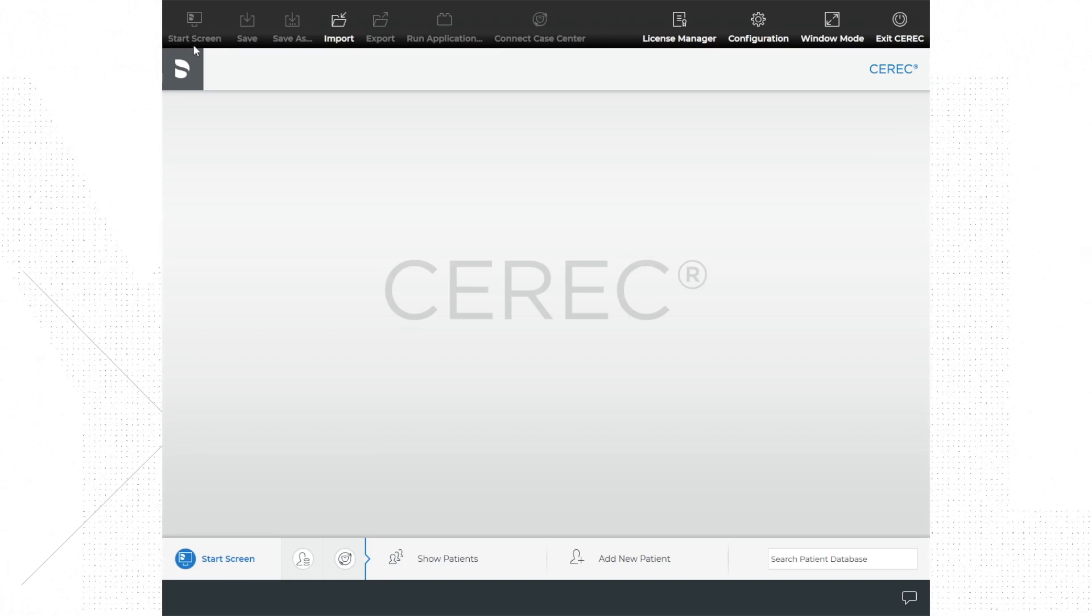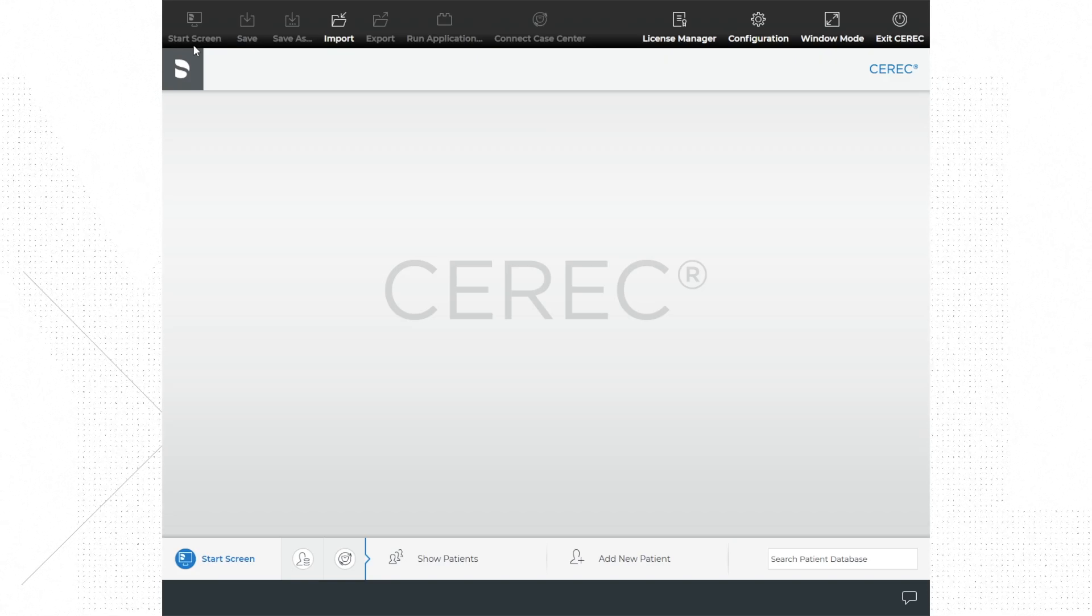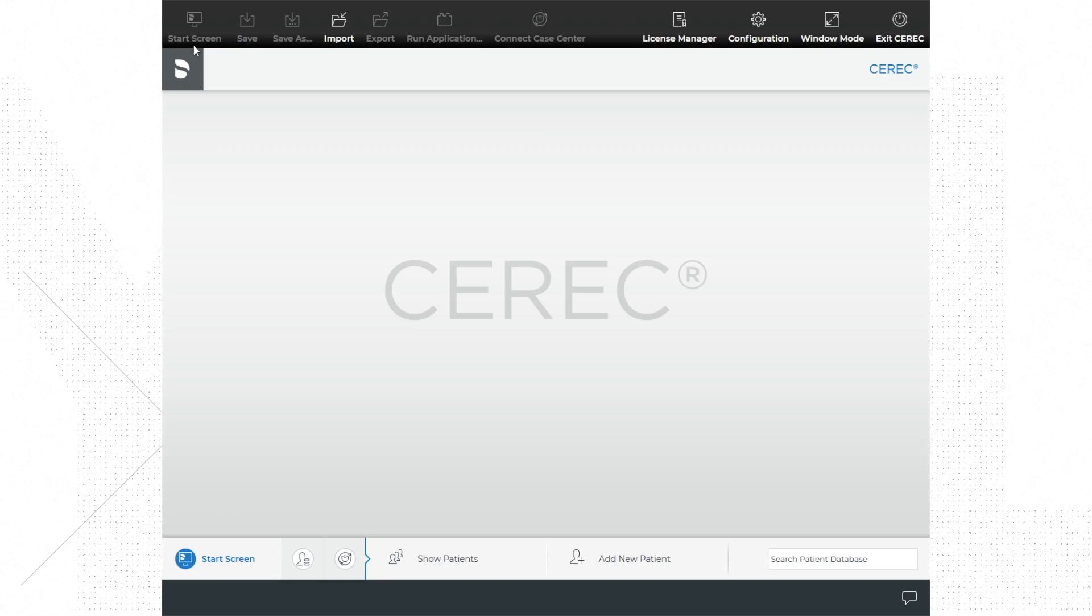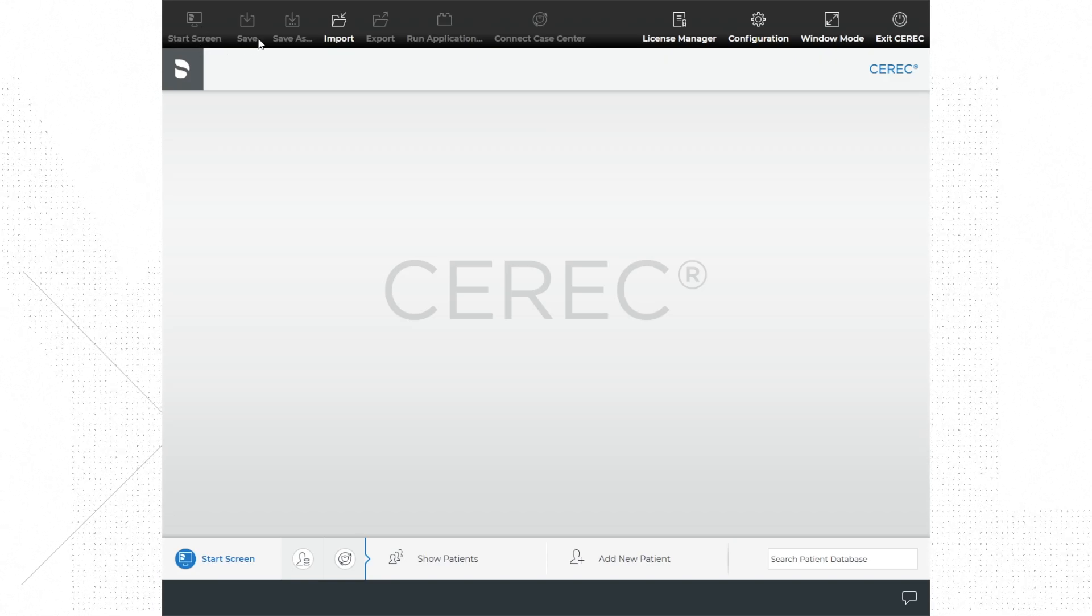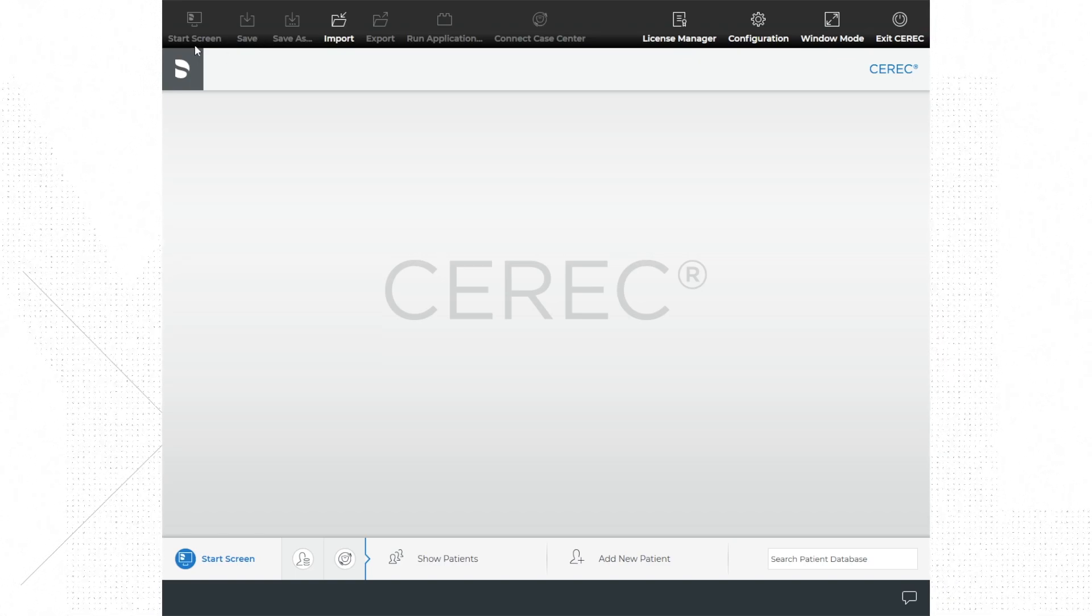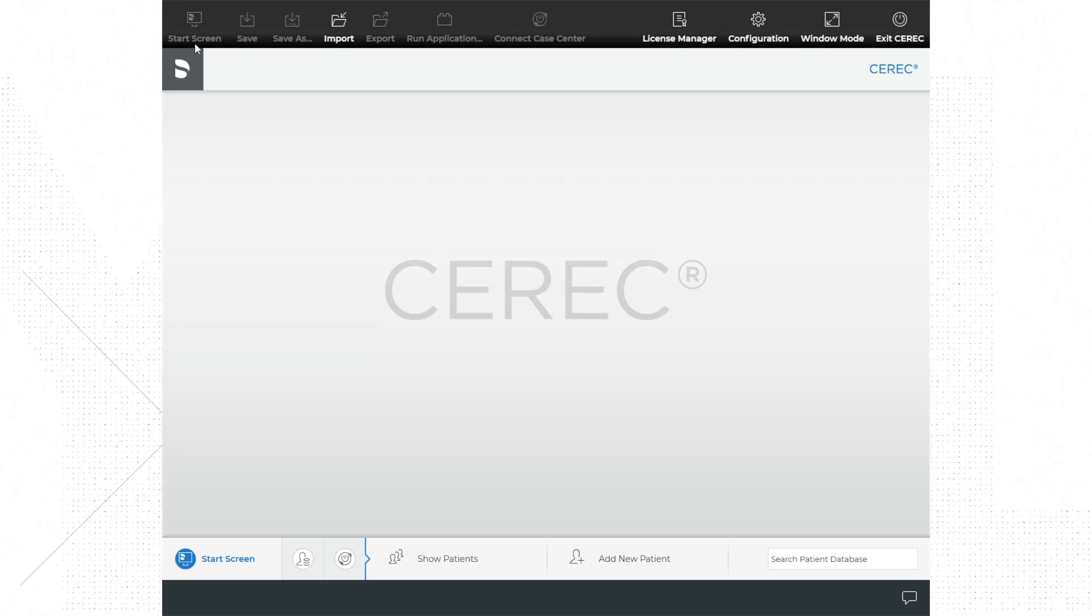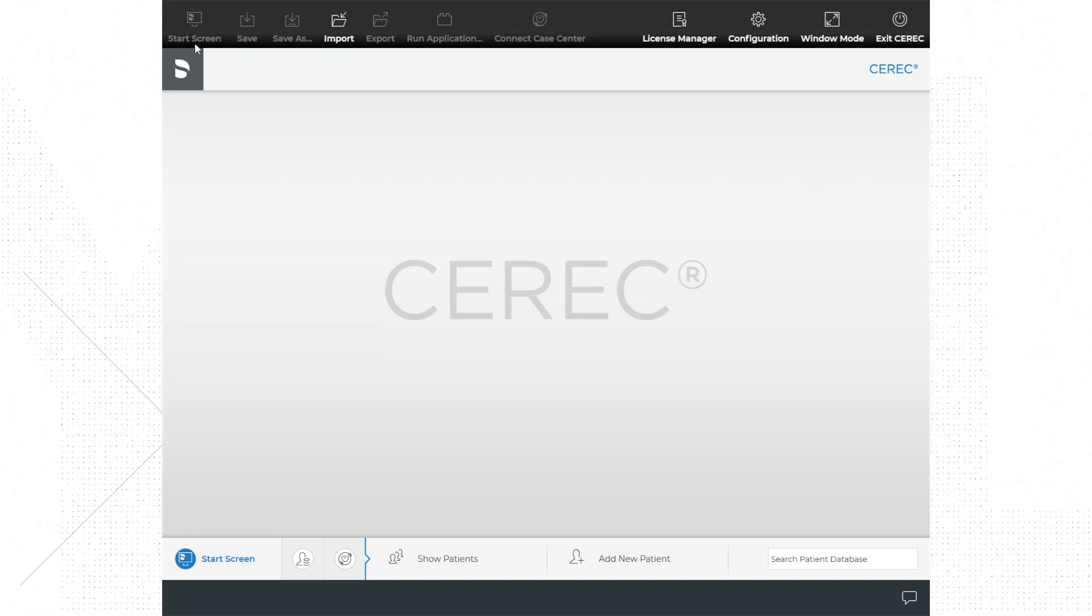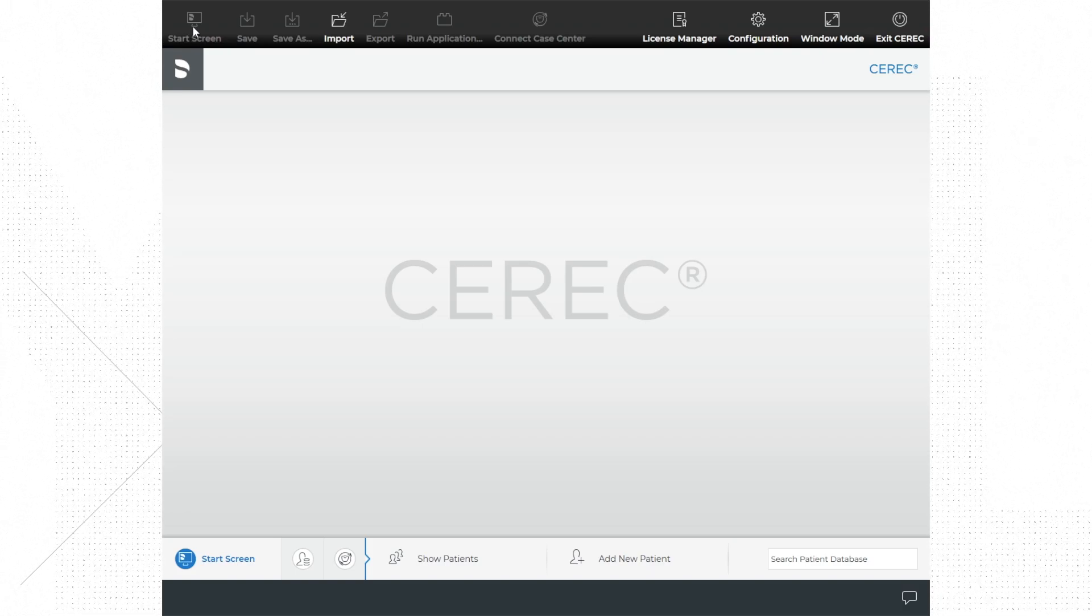Sometimes you will see an icon for the start screen that will give you the option to go back to the start screen within the software at any point while you're using it. Save case allows you to save work as you progress through the case.